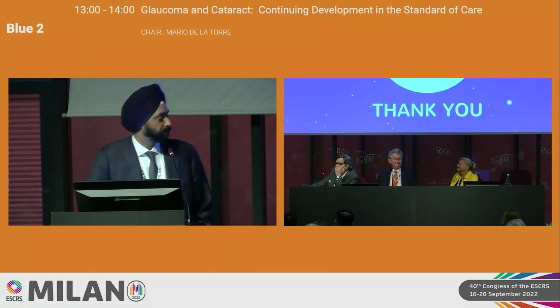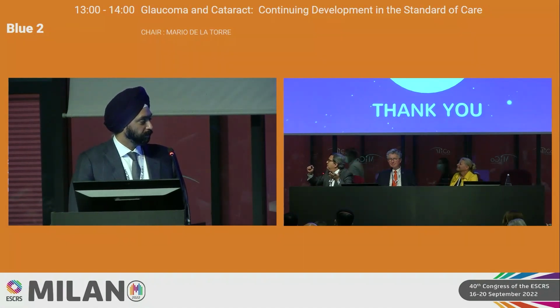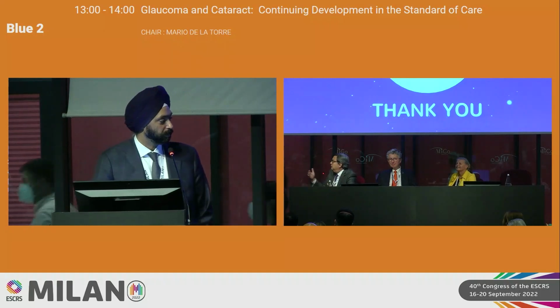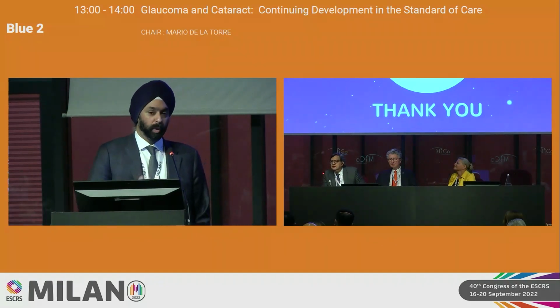Paul, many people are afraid because the experience with ALT was that it caused damage to the trabecular meshwork, and some people always begin with 180. But I realize that 360 is the best option. Do you agree about that? To me, we don't know where the resistance to outflow is.